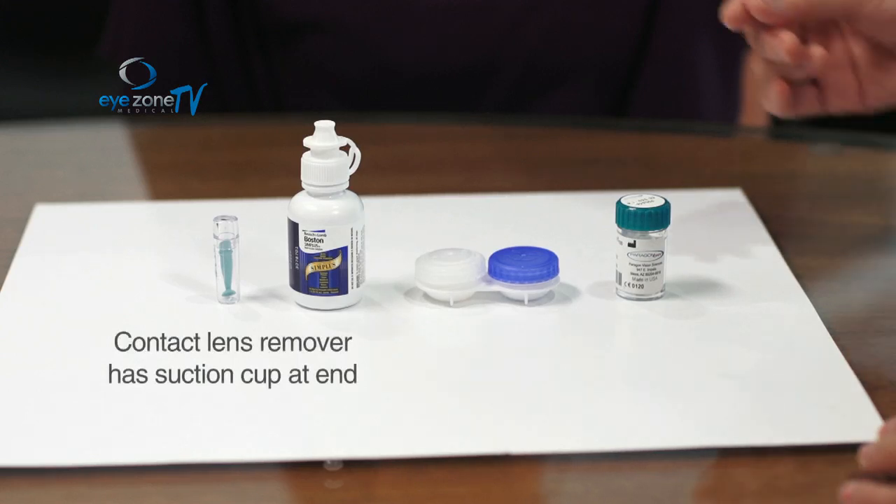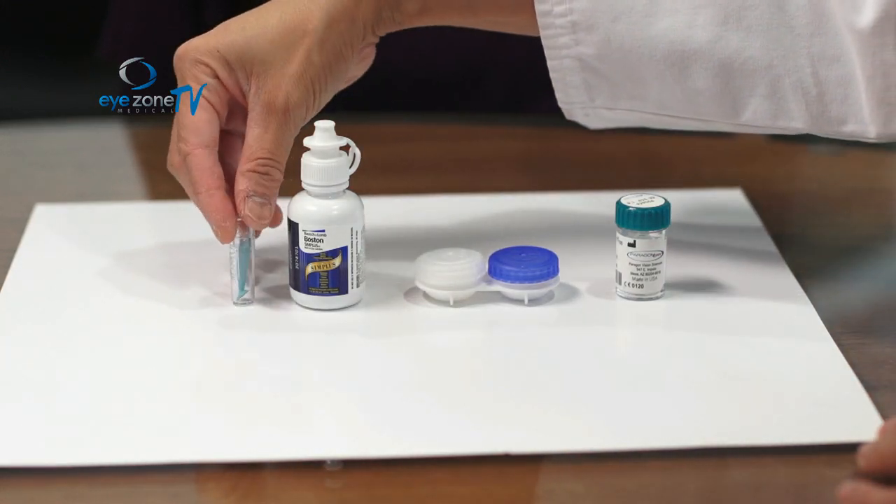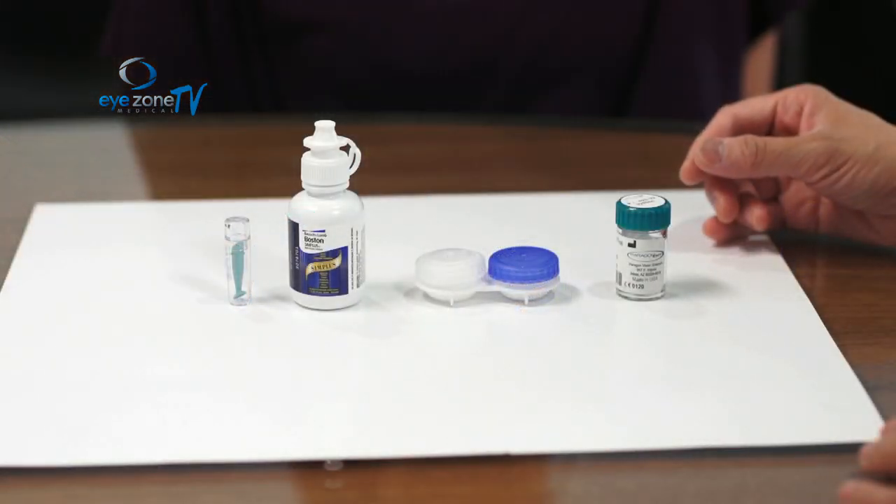The last thing you're going to need is a contact lens remover — I use a little plunger to help with that. The contact lens is designed to hug your eye very tightly, so it's hard to just pop it out. We'll use the plunger to remove it easily.